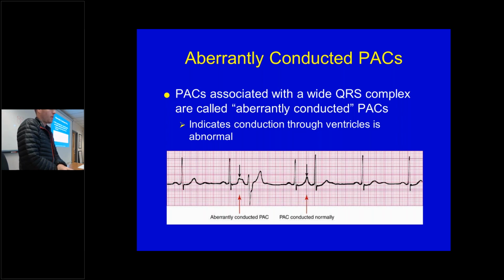Well, because that second one, there's no T wave either. Right. So the PAC, that premature contraction, contracted before real repolarization from the ventricle. You can even see it, look at the other T waves and see how it doesn't have the same morphology as the other T waves. Oh, yeah. Right? So we see that, and see it's higher than P. It's probably the difference is because there's a P wave in there. Right, P at the same time, which causes that elevation. Okay. You just have both impulses seen in that.